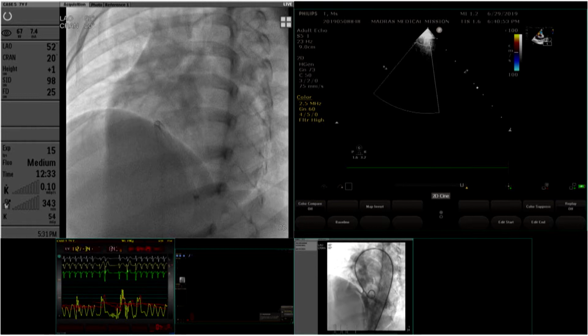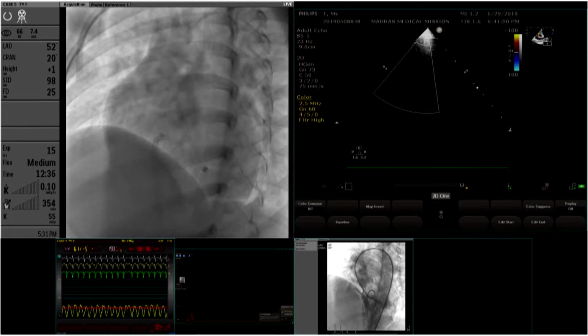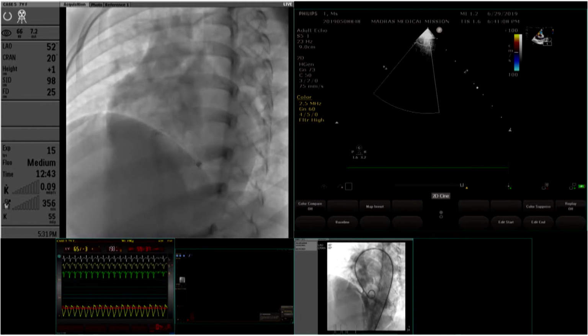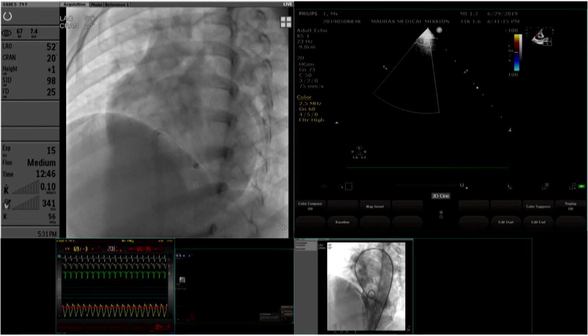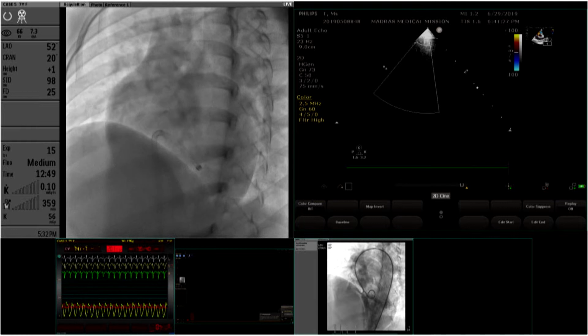Now there are some ventricular ectopics. Wait. Don't push it inside. There is a supraventricular tachycardia. Can you give one? What size have you chosen, Shiva? No, one second. I'm planning to choose a 6, but there is a supraventricular tachycardia. Just a second. Yeah. Can we get some metoprolol in? Yeah. Quickly get it. 2 mg. Or do you have adenosine? Whichever you are getting fast. You can just try a thump on the chest, and that very often works as well.